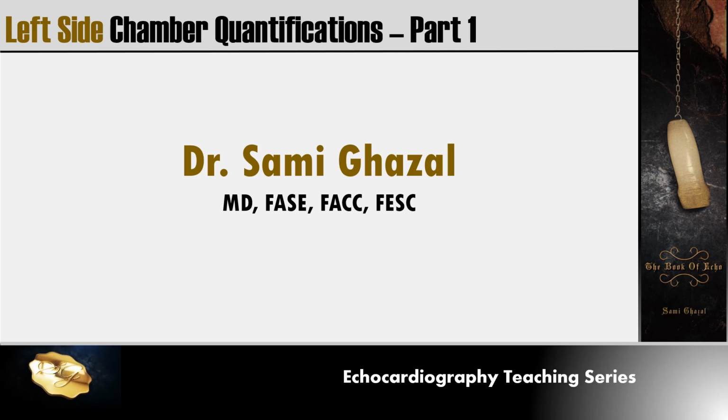Welcome to left side chamber quantification part 1, where we're going to discuss LV size and its assessment, LV segmentation and wall motion analysis, as well as LV systolic function assessment.